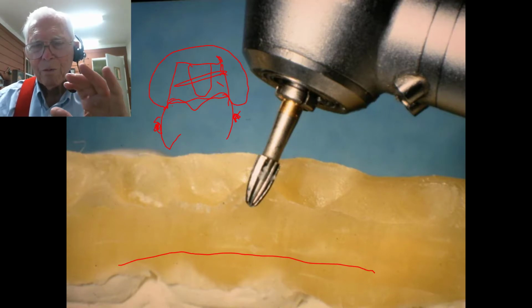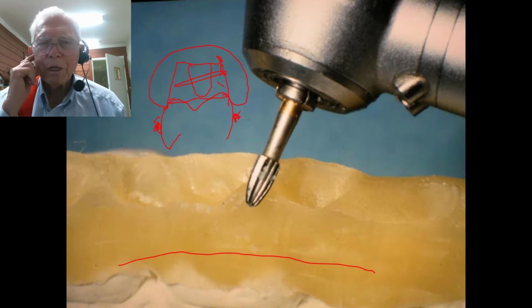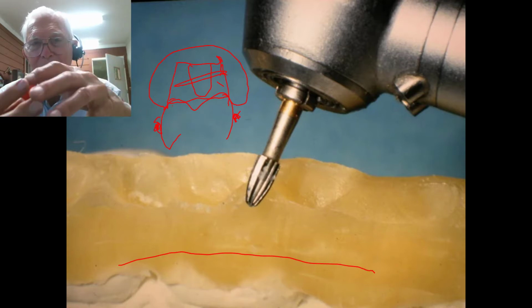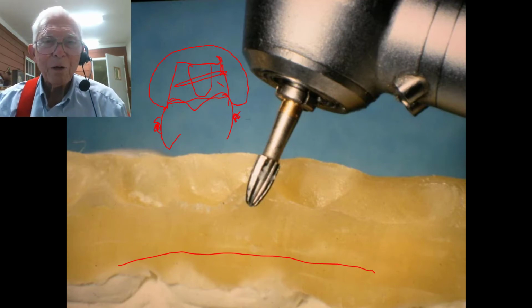But there are some marvelous things you can do with bonded blocks. You could take a person coming in with a TMJ problem, and if you bring their jaw forward and block it like that, then you put the force right between the teeth, and that person could feasibly be completely relieved of that. But then you've got to be able to take these teeth down and move this jaw together where it fits together in this forward position, and that's where the work comes in. See, there's a lot of ways of doing it.